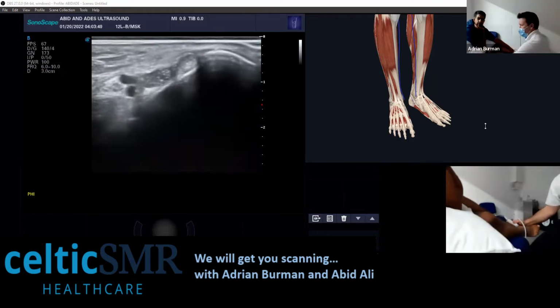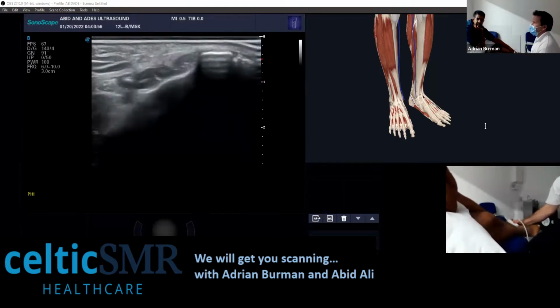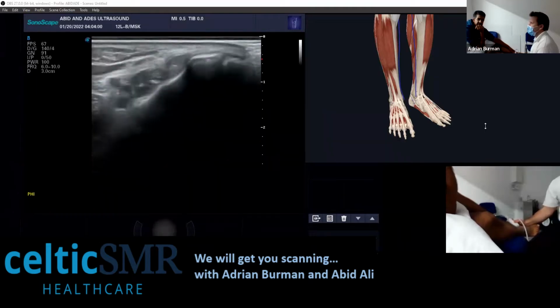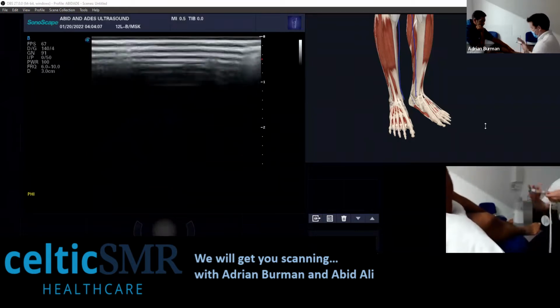Just a comment on the neuroma thing. I think, maybe if Adrian agrees, it's always good practice to do a full forefoot examination rather than just look for one specific condition. It's good practice to get into, I think. So just assess your MTPs and plantar plates at the same time.